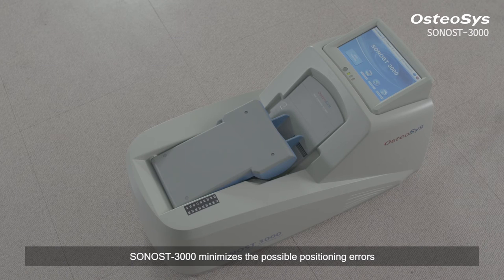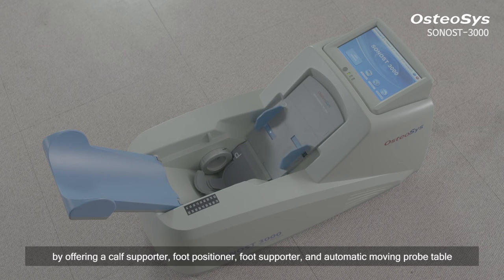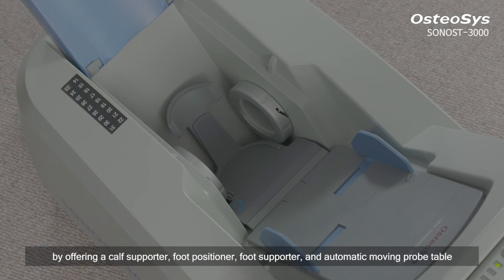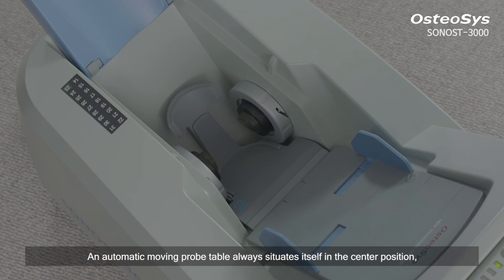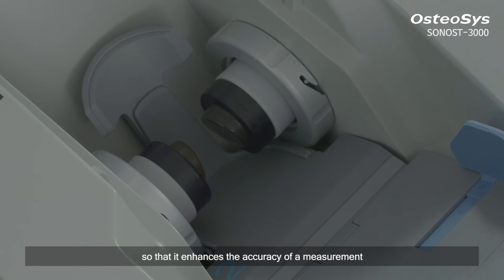SONOST-3000 minimizes the possible positioning errors by offering a calf supporter, foot positioner, foot supporter, and automatic moving probe table. An automatic moving probe table always situates itself in the center position so that it enhances the accuracy of a measurement.